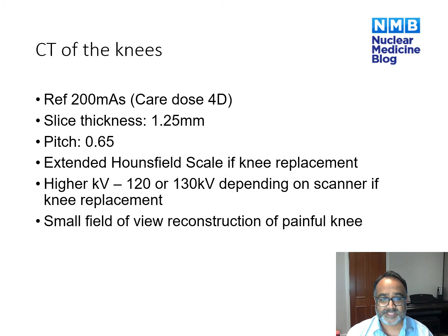We also use an extended Hounsfield scale if the patient has a knee replacement, and a higher KV than normal, just to overcome the noise from the metalwork. We also perform a small field of view reconstruction of the symptomatic painful knee.